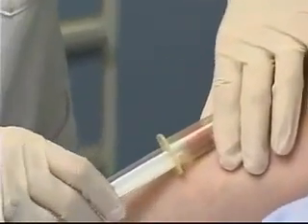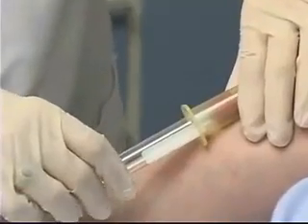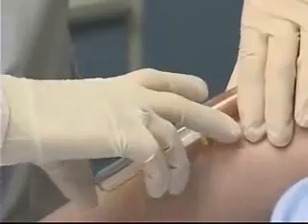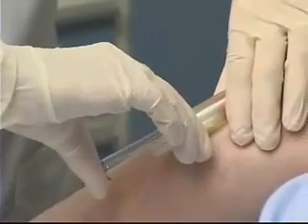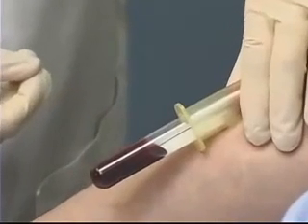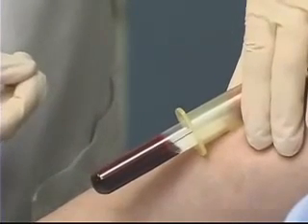At a very small angle, I'm going to insert the needle through the skin and into the vein. I'm now going to change the position of my left hand so that I'm steadying the vacutainer holder, and that enables me to push the tube into the needle, creating the vacuum and allowing the blood to flow.